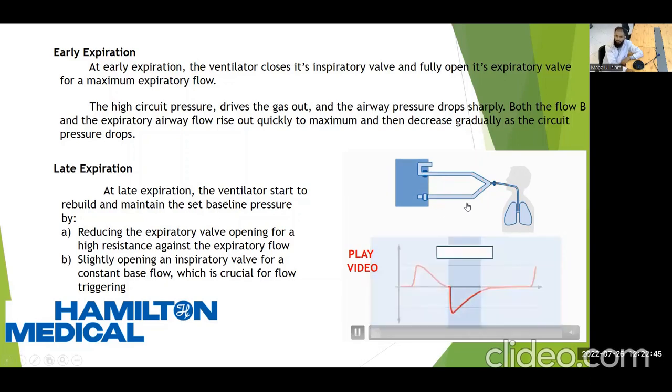Again, see the video. Let's consider an expiratory phase is going to start. The inspiratory valve is fully closed. The airway pressure drops, air goes out from the lungs, and the expiratory valve is fully open.